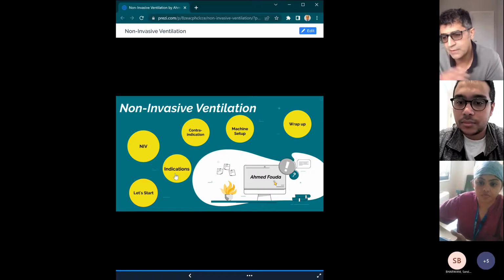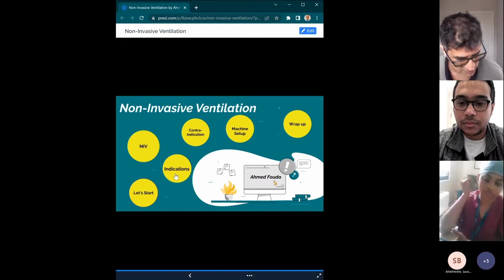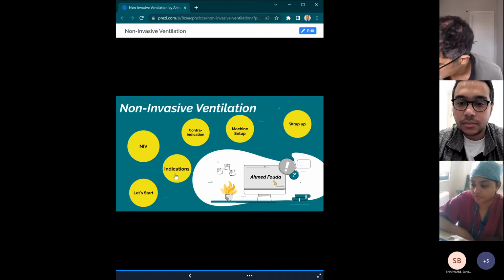We've spoken about, if you have somebody on CPAP for a long time, while it can be quite claustrophobic, it can get very hot. You see these people, certainly when it's humidified, they get quite hot and sweaty, and they find it uncomfortable. They're already struggling to breathe. It helps them, their oxygenation.